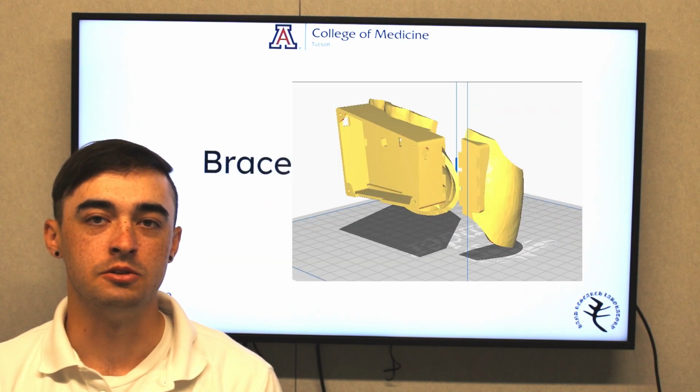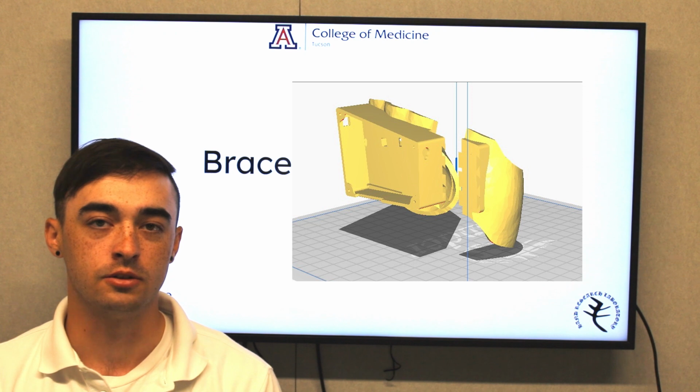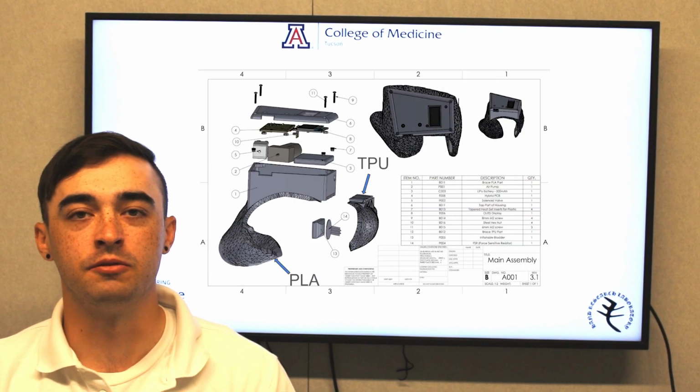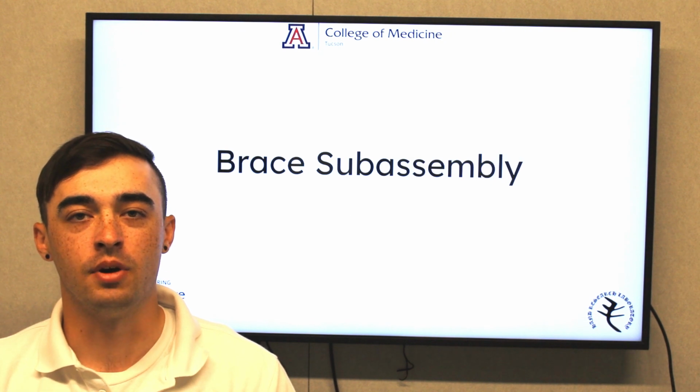Additionally, SolidWorks was used to split the model into 2 interlocking parts. The larger part was 3D printed out of rigid PLA, while the smaller part was made of flexible TPU. This composite construction simultaneously provides proper bracing of the thumb, as well as allowing enough flexibility and bending for proper tightening and fit, thereby preventing force loss through looseness.